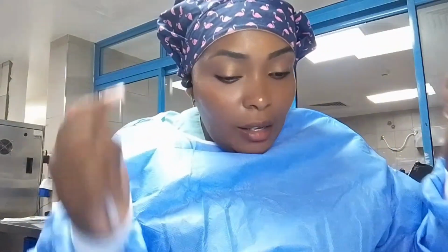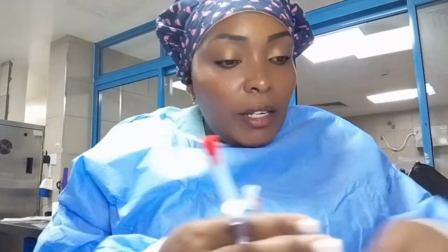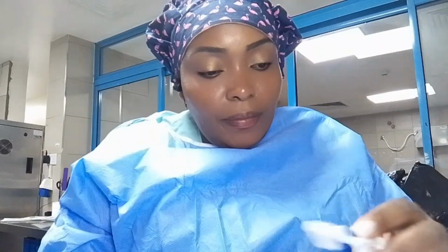They're called dilators. When you maybe don't have an assistant, you have to prepare yourself so that you can pick things easily. So you will start with the finder needle. Before you take the dilators, you need the guide wire.